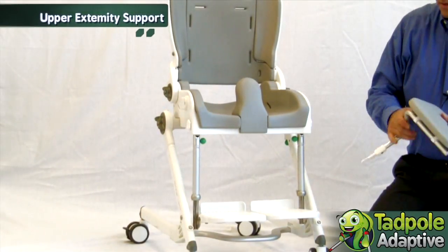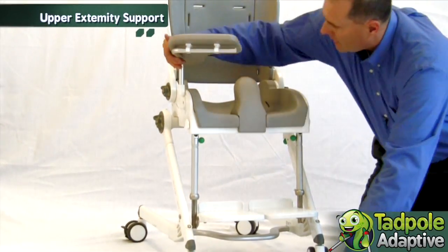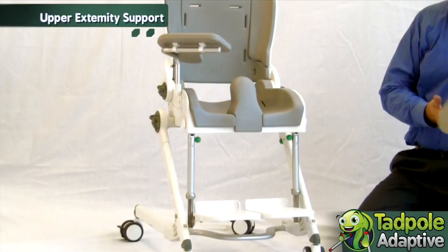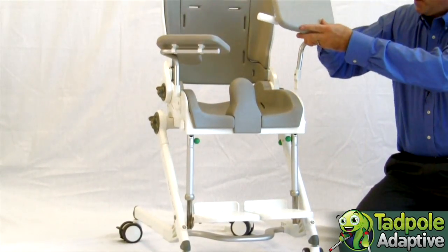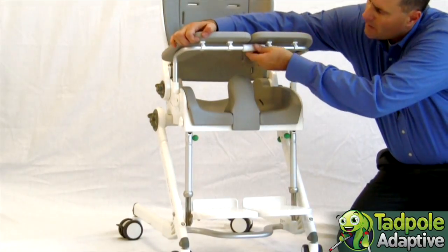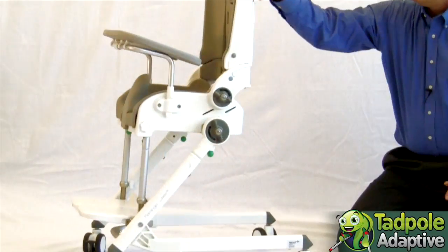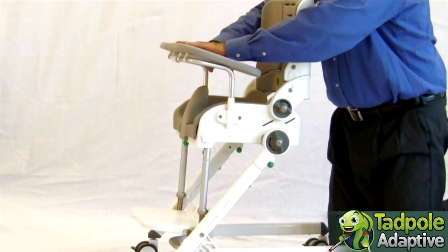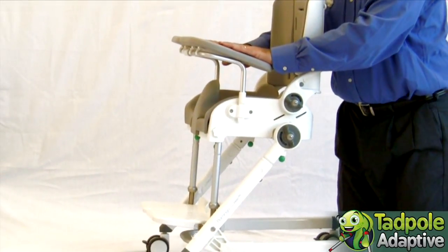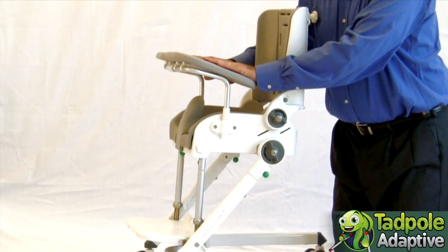Lastly, we offer an accessory that plugs on that is an upper extremity support. This support surface is especially good for weight bearing through the forearms as you complete a bowel program.